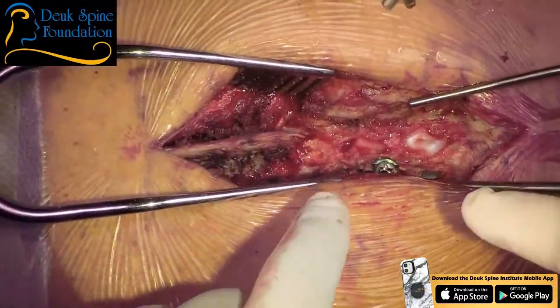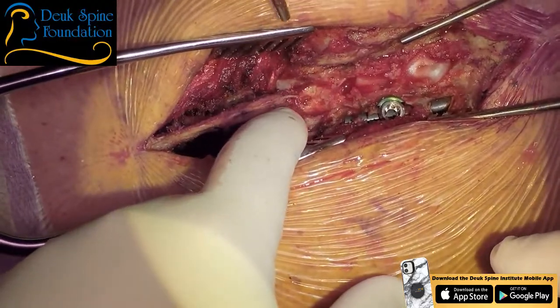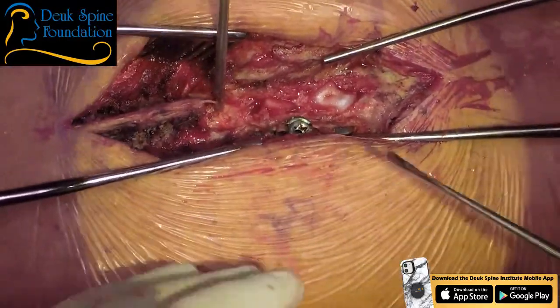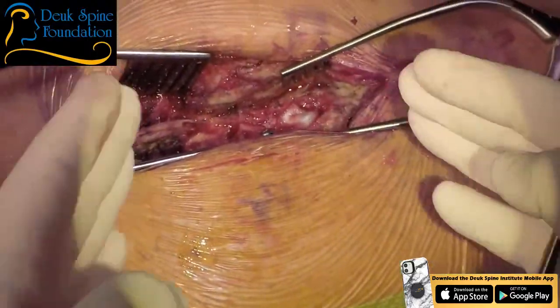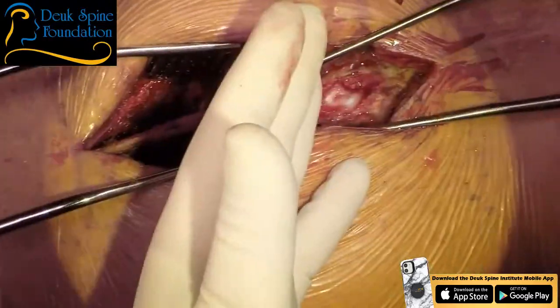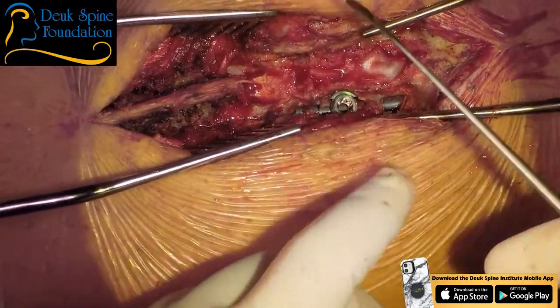So just so everyone can see, I want you guys to see this. All right, I'm gonna go in there with a Woody and a K2, okay? You wanna point? Yeah. So folks, just so we understand, this is the revision surgery. I've already done a massive fusion on this patient up to T11. That's what that screw is, the top screw.